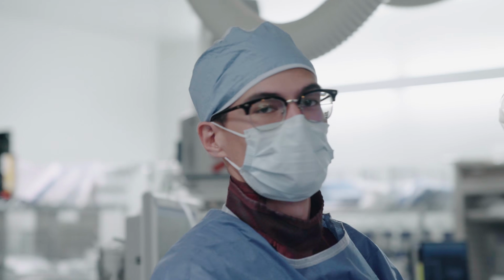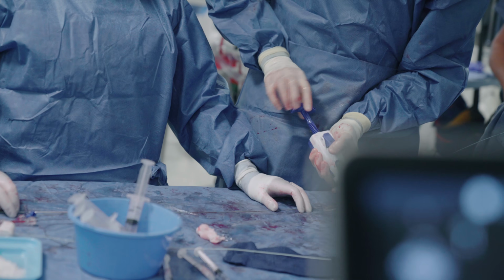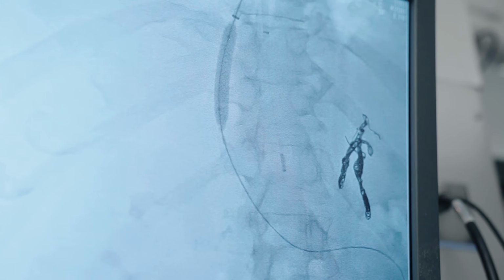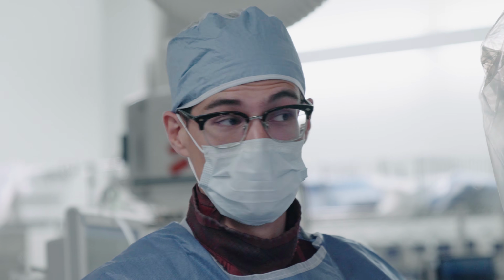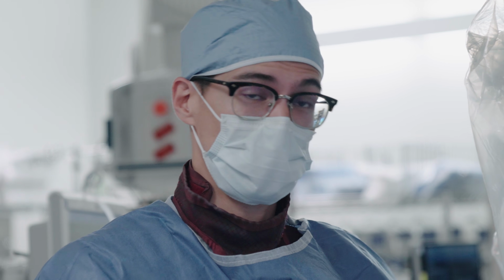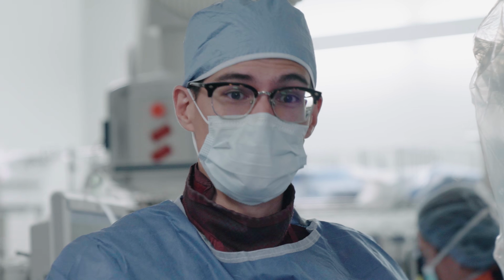Okay, so we have to measure how long our stent graft is going to be. We use this pigtail catheter that has centimeter markings on it, kind of like a ruler. We've dilated the tract with a couple of balloons. We're going to put the sheath across the tract that we dilated, put the stent through the sheath, and then unsheath it.